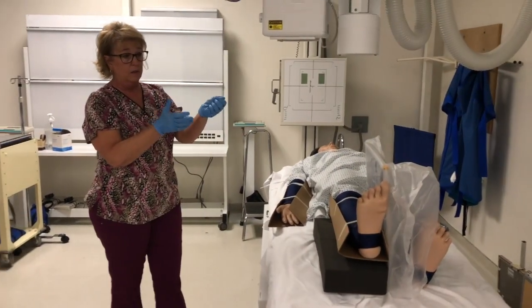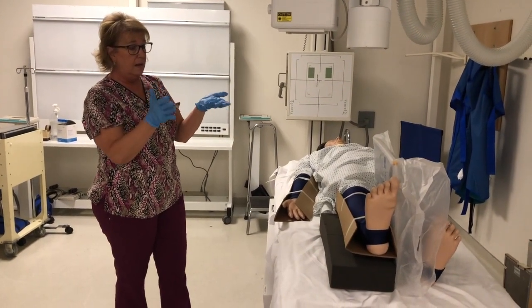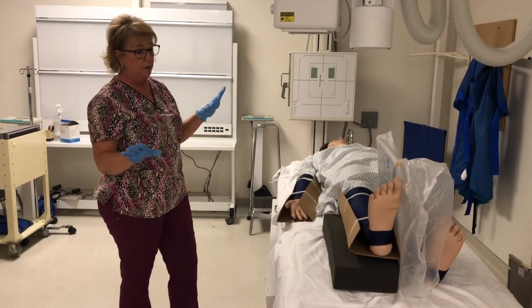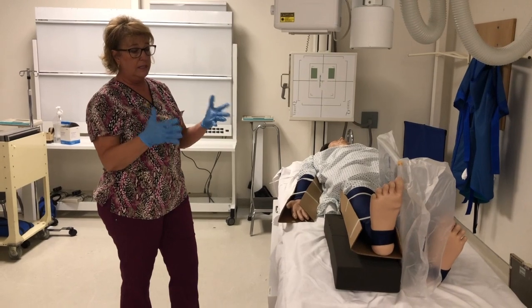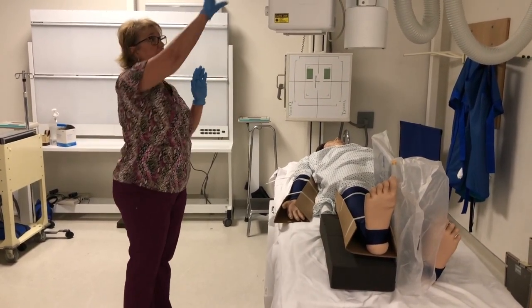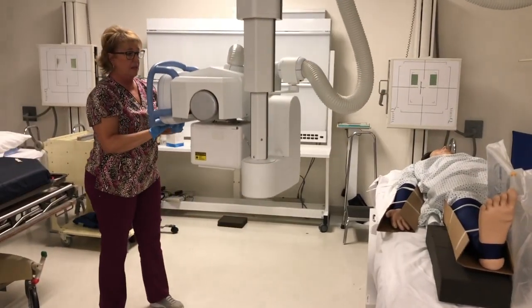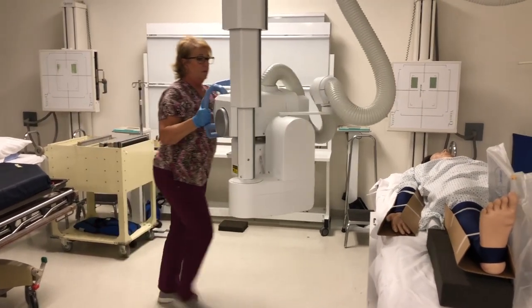Again, if I was the only one, I would keep the same set of gloves on and change them and wipe down the whole room afterward. If I was the dirty tech, I would keep my gloves on and have the second tech come in and do this. But you'll learn all the aspects of this in your clinical rotations.